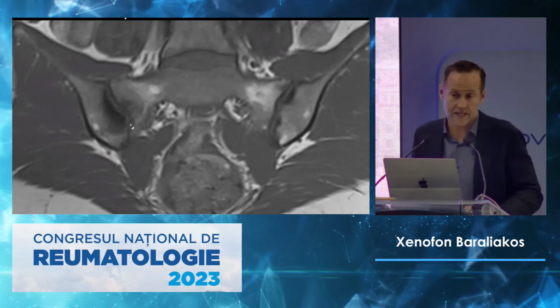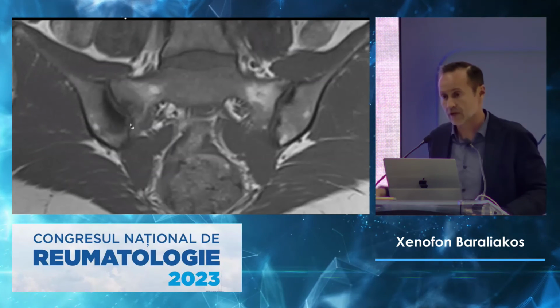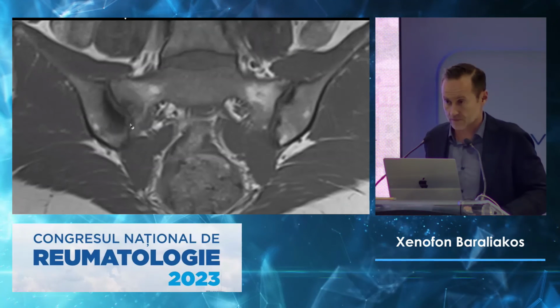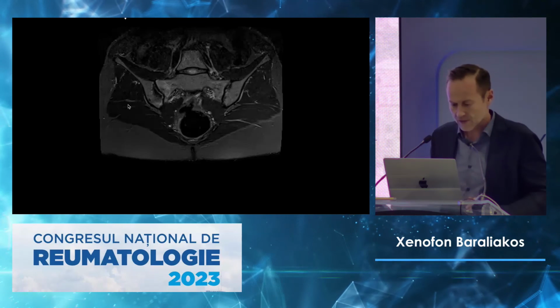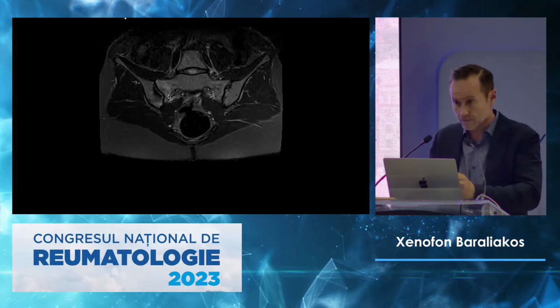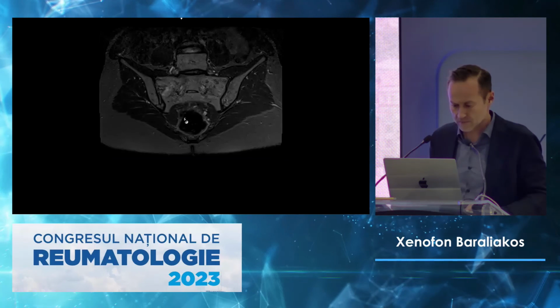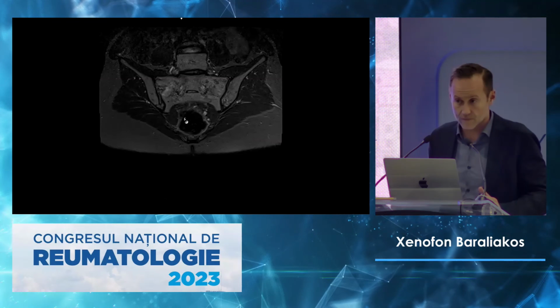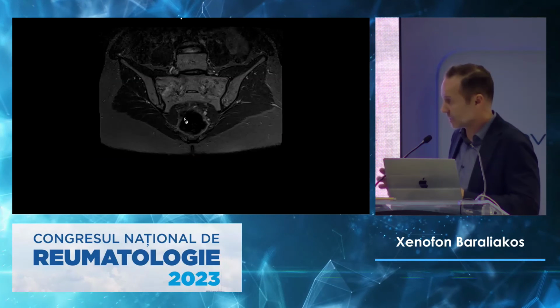So you don't even need an X-ray here to say that this unilateral bone marrow edema in a young woman with a lot of sclerosis and no erosions is osteitis condensans. The important thing to remember is that this is indeed a lot of edema, but it's in the very front. Here is the bowel. When you go towards the middle of the joint, you lose it. There's almost nothing. But this picture is more impressive because that bubble of edema is large.